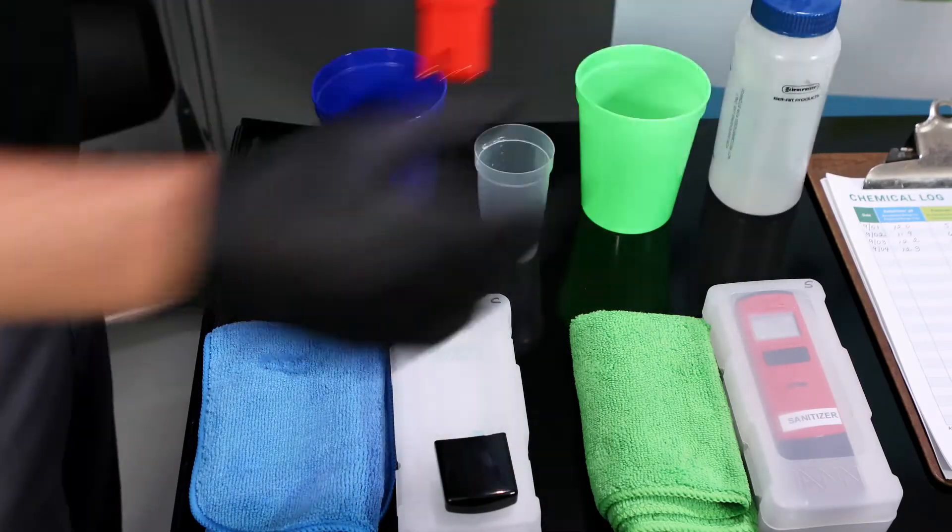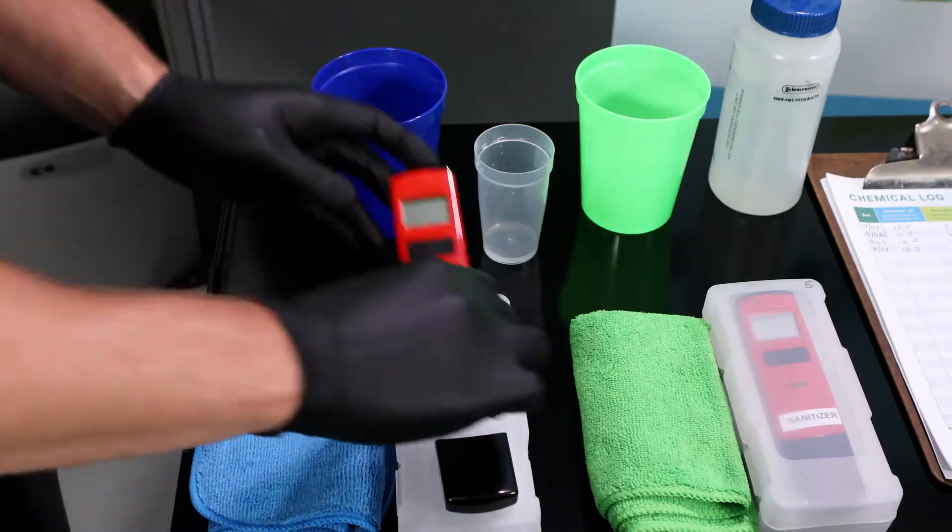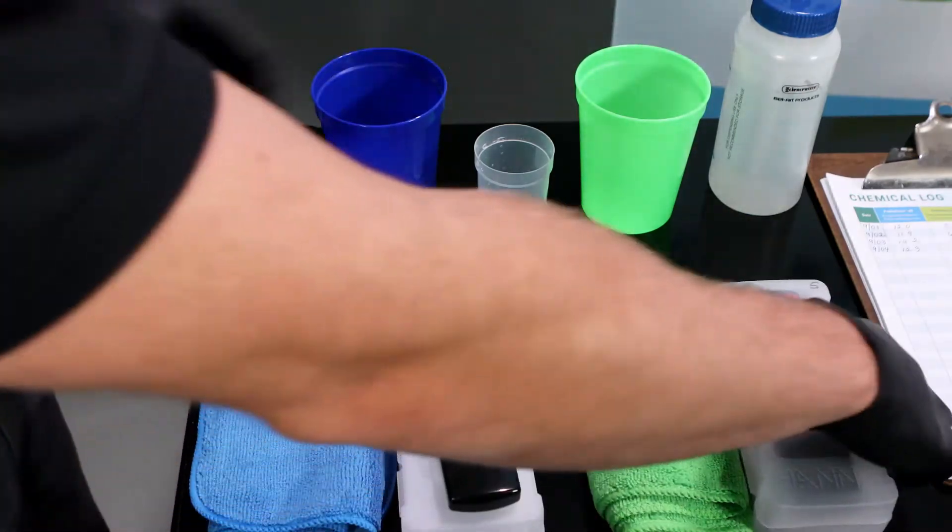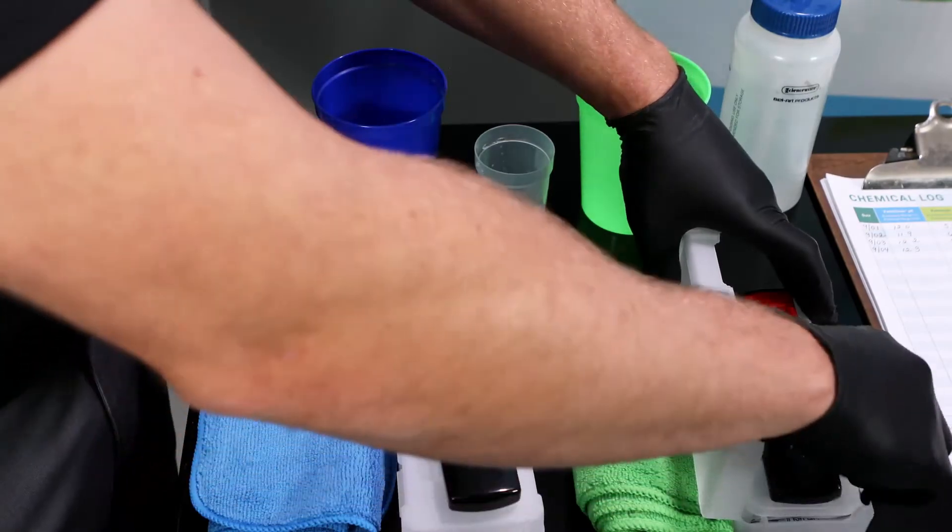Remove each meter from its case and remove the cap from the bottom of each meter. Rinse the exposed electrode with tap water and shake gently to dry or blot dry.